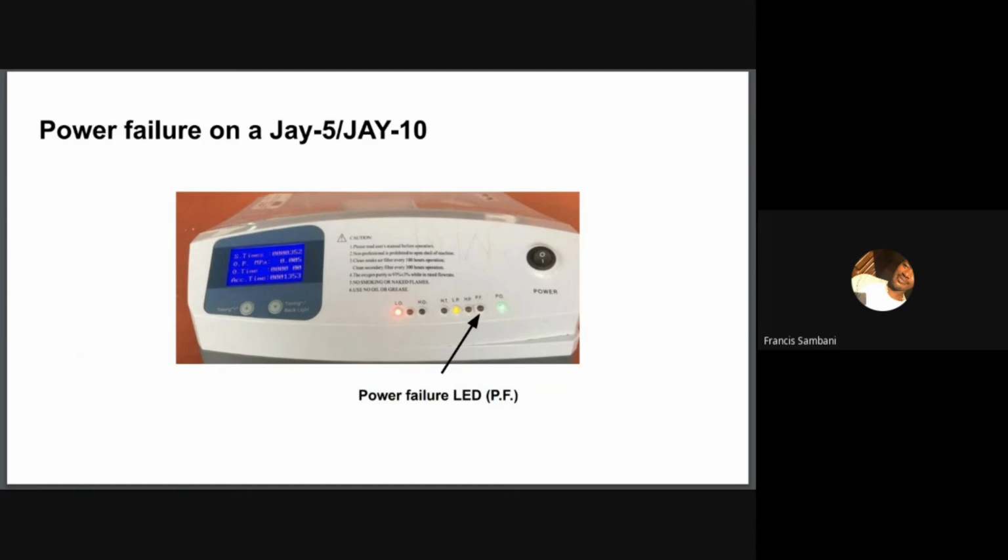Looking at the Devilbiss 1025, the audible alert will activate for a minimum of 2 minutes in a no power situation. So you don't have a visual indicator for this alarm in the Devilbiss 1025. And if this unit is turned on without power or power is removed later, the alert will sound within 10 seconds. After a time, the alert will produce an audible burst every few seconds. Power for this alert is usually provided by a capacitor on the control board.